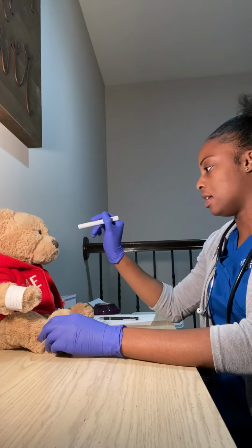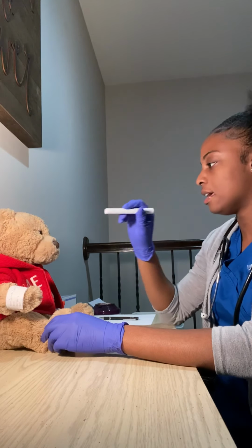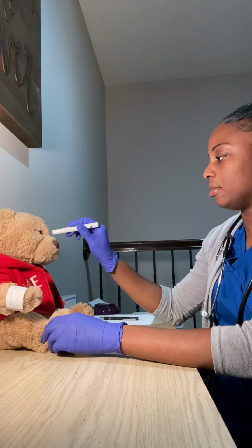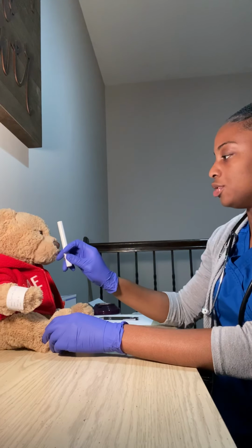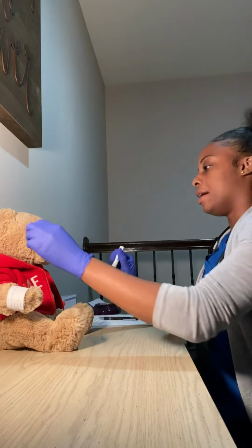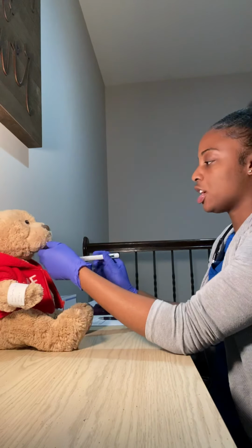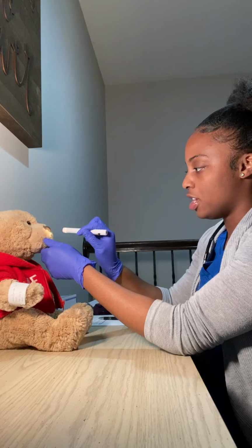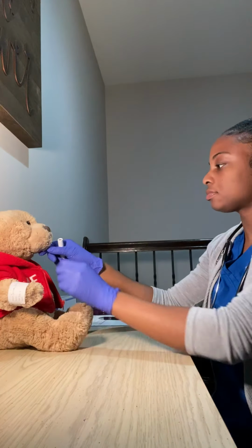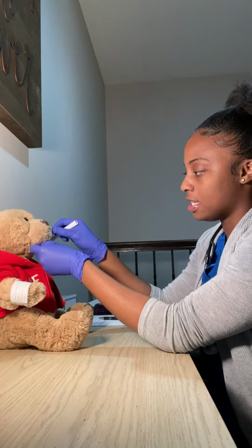I'm gonna go ahead and assess her eyes. Eyes are reactive and they constrict and dilate. And I'm gonna come in forward, bring my pen forward towards her nose. Okay. The sclera is white and moist. Eyes are not dry, don't seem dry at all. So I'm gonna check her nose now. There's no drainage there, no scarring. And then her mouth, I'm gonna smell her breath. I'm going to assess her gums. Looking at the teeth, they're nice and pink.